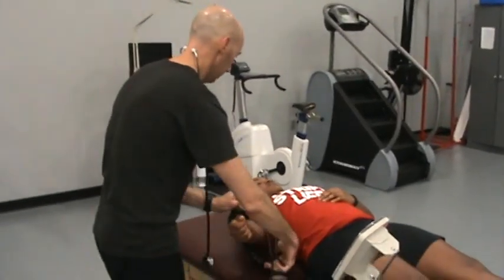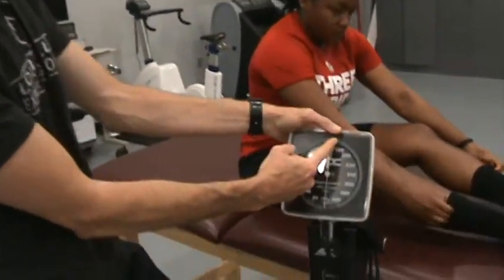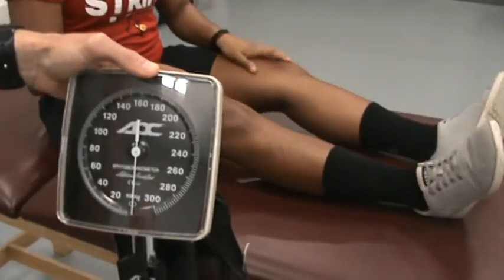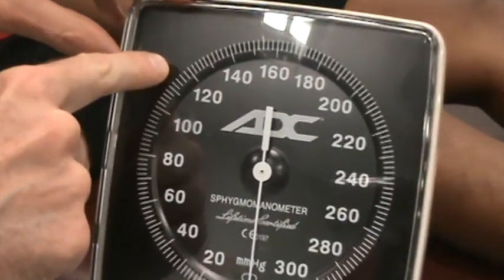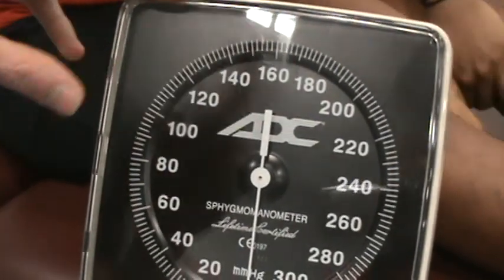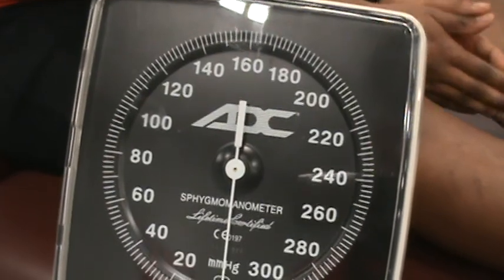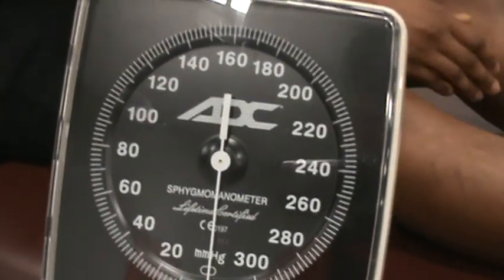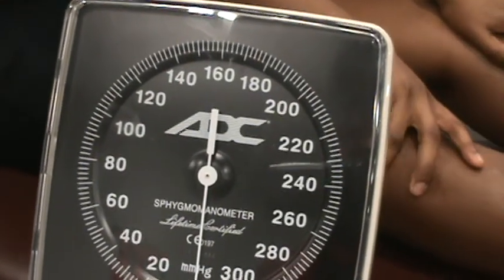How about that, Lindsay, okay? Okay, so what I was listening for was the first instance of sound. So I'm watching the dial. The first sound I heard occurred when the needle was at the 118 mark, okay? So that represents my systolic blood pressure. So for my blood pressure, I'm going to write 118 down. Again, the first sound you hear, that's the systolic blood pressure.